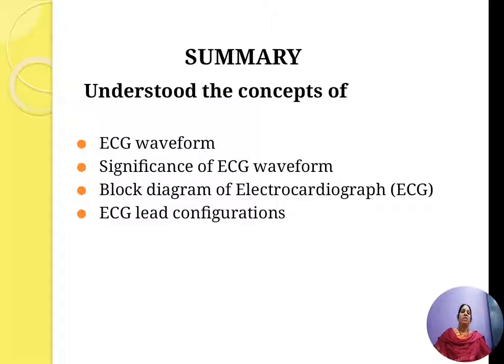I would like to summarize my presentation. I have dealt with the topic ECG waveform. What is ECG waveform? It is a graphical recording or display of time variant voltages produced by the myocardium during the cardiac cycle.